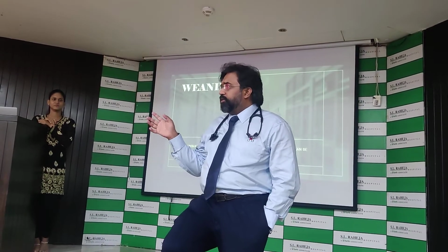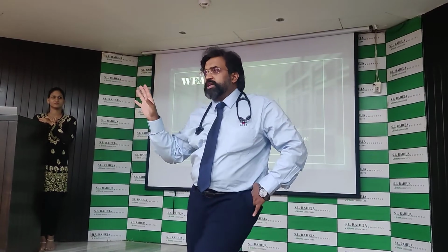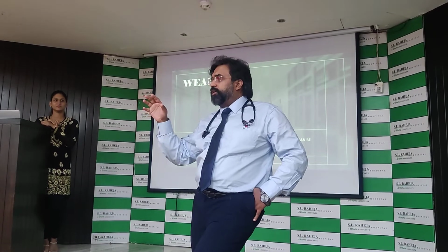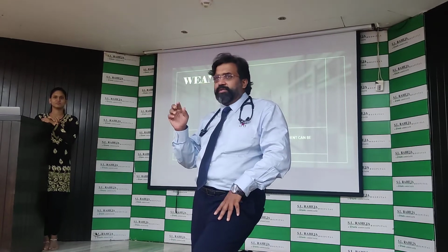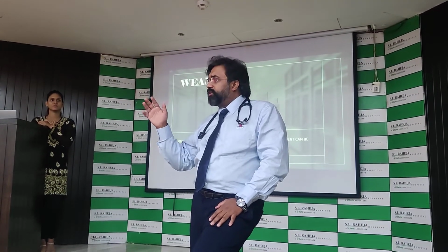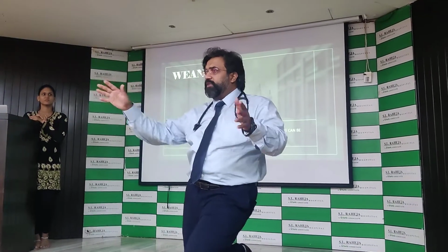So in this ventilator, say this patient has come in, for example, the patient on top who's on ASV now. So we put it on 120%, we put on 130%, and then we leave it, forget it. Now there is a white box where you'll see whether all the parameters are in the right place, whether the pluses are right inside the box that we talked about. You will look at that, and if it is in that place, you are comfortable that everything is looking well.